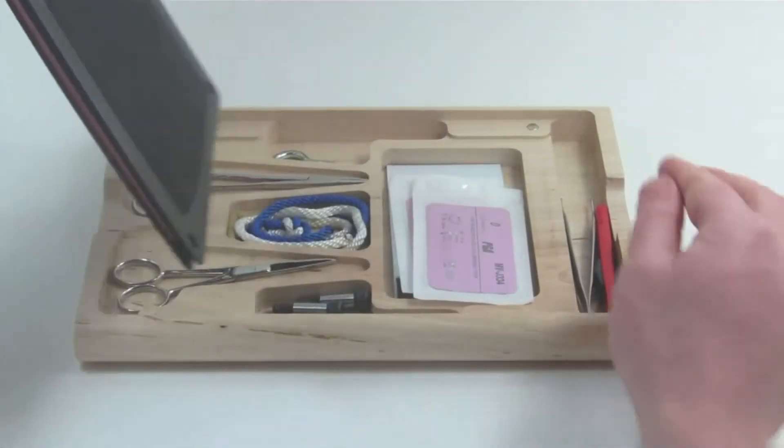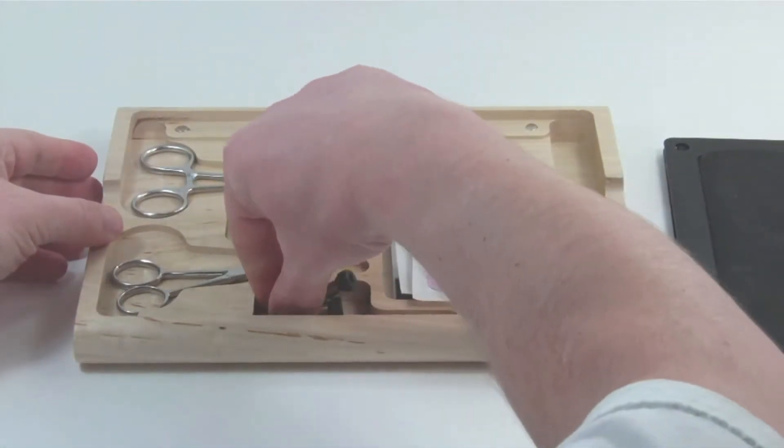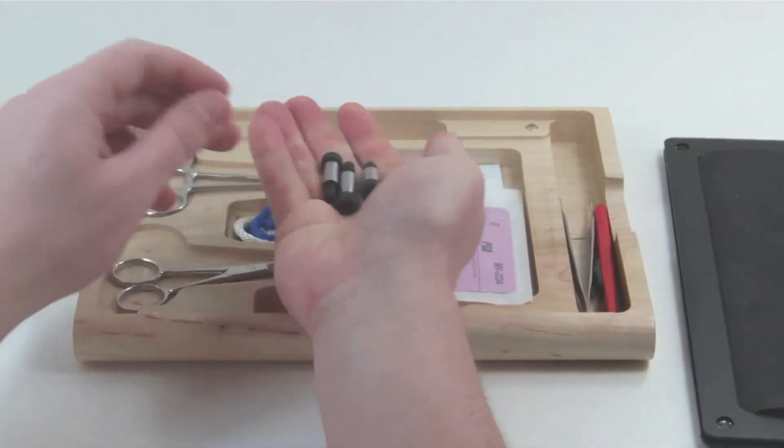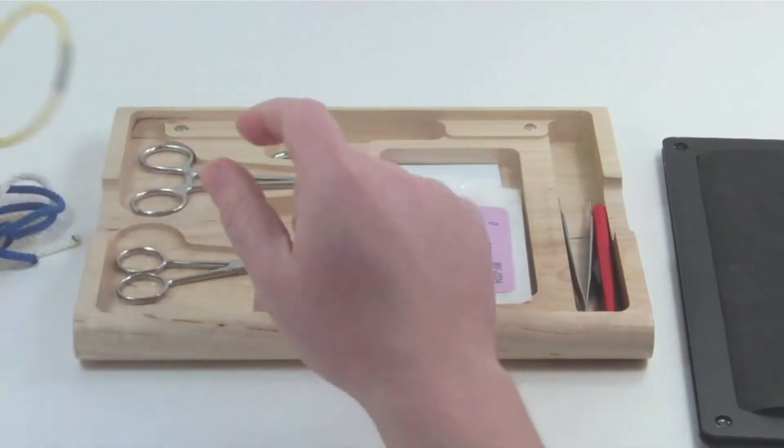Inside of the Sews Kit is everything you need to practice two hand ties. There are three posts, a rope, and a ligation band.